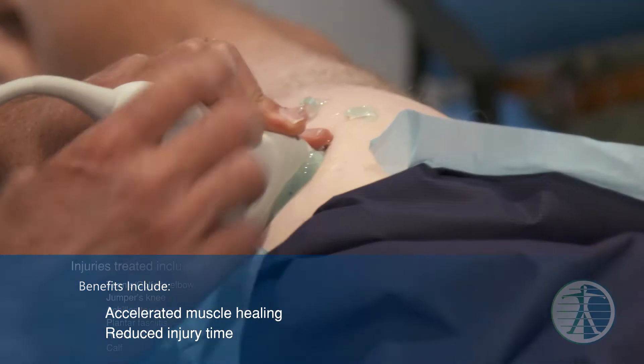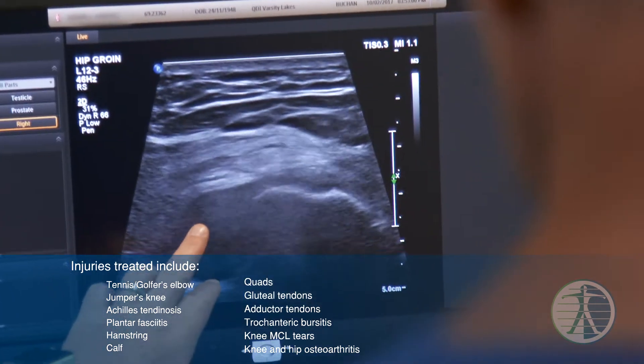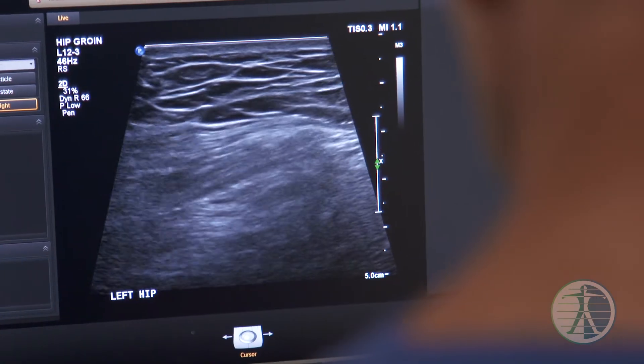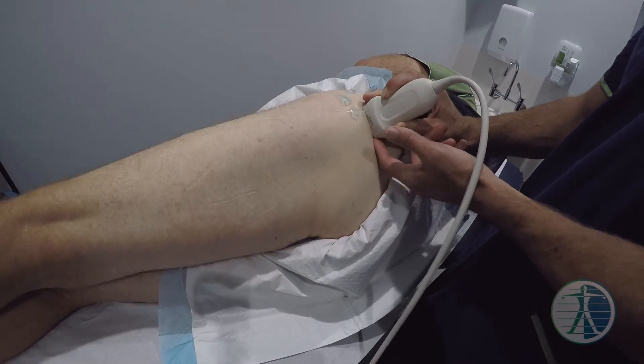So I'm going to go to this fluid. Randall has a proper decent-sized tear of that tendon and if we can get that to heal, to start healing, then that's the end goal of what we're trying to achieve.